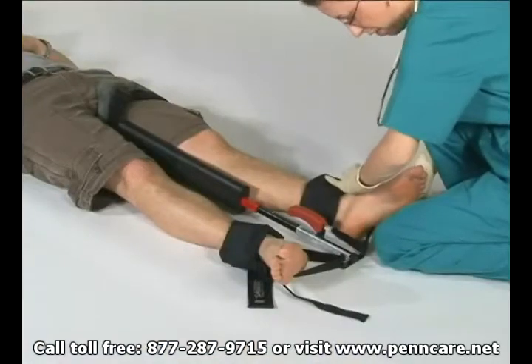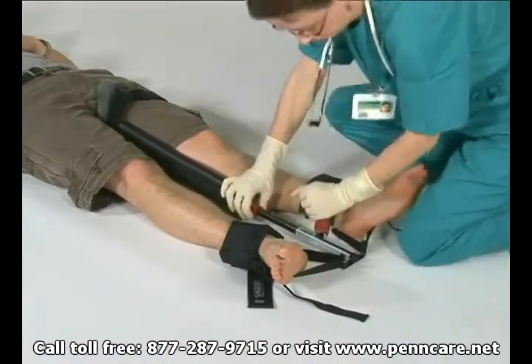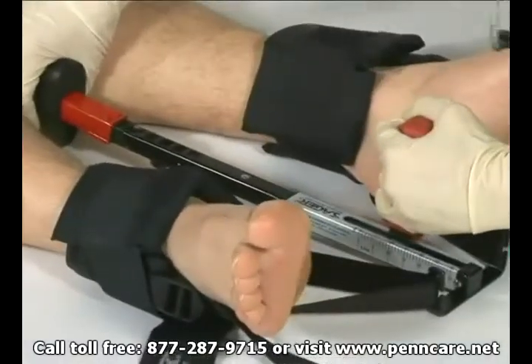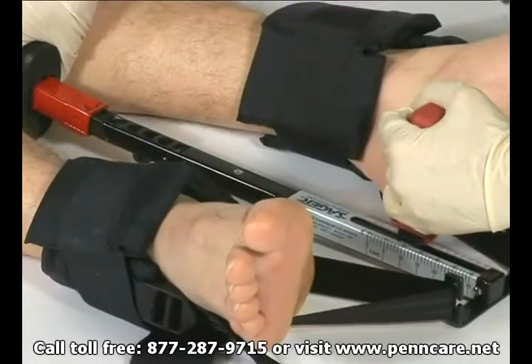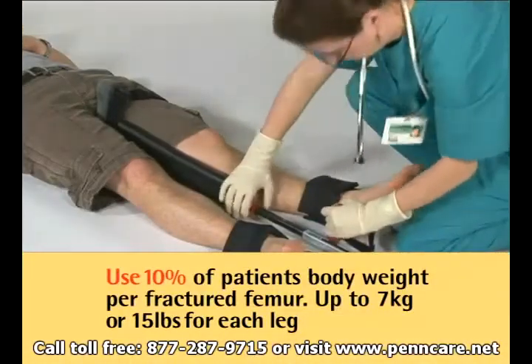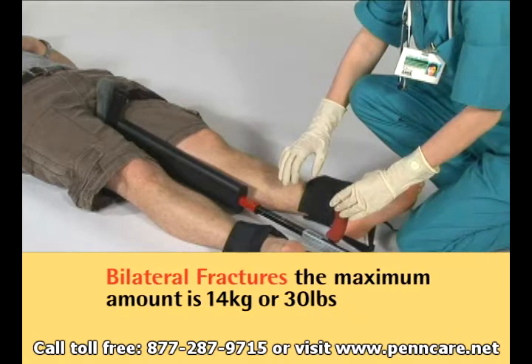Apply quantifiable dynamic traction. Grasp the padded shaft of the SX404 with one hand and the red traction handle with the other. Then gently extend the inner shaft until the desired amount of traction is recorded on the traction scale. It is suggested to use 10% of the patient's body weight per fractured femur, up to 7 kilograms or 15 pounds for each leg. If bilateral fractures are present, the maximum amount should be 14 kilograms or 30 pounds.